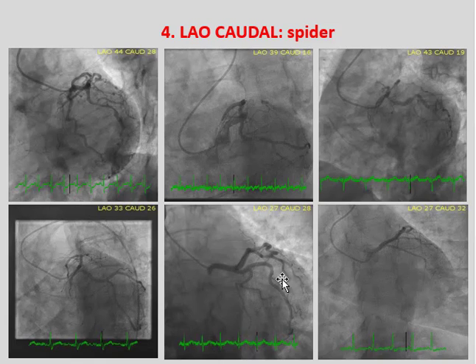I know this will be the LAD and that's the circumflex. This one could be anything because we can't see too much of it, and we get used to that because it happens frequently. So there are four basic views that I think you should understand. They're not that complicated. The right coronary you should also remember fairly well.